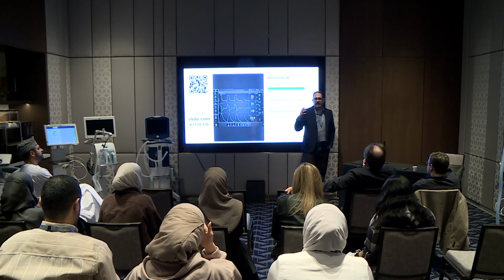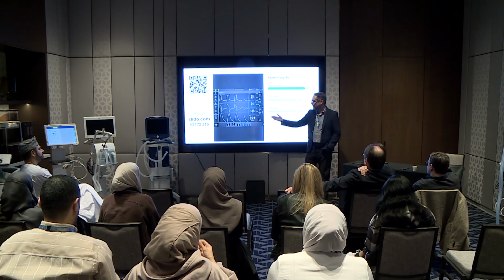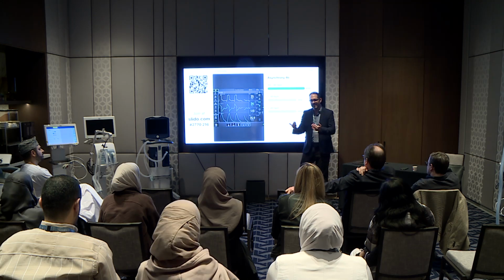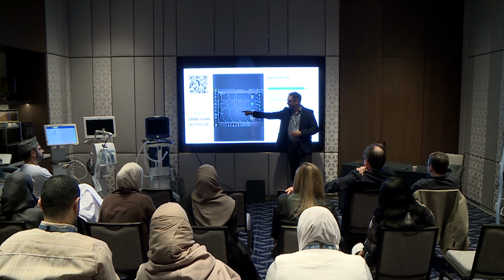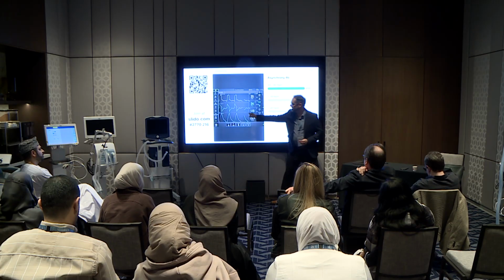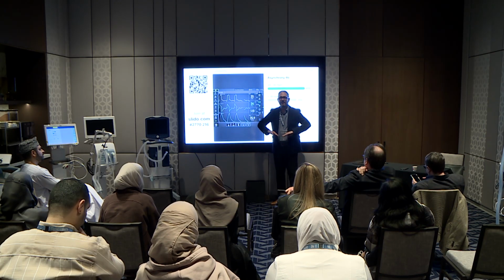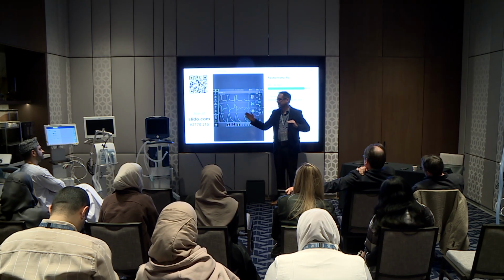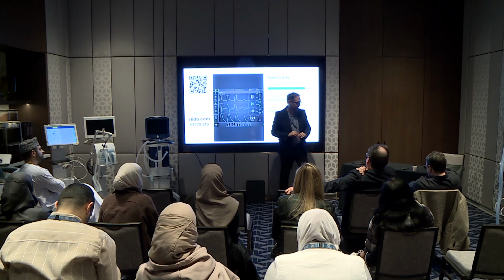So it's important that when you unmask this, you don't immediately go back up. Or if I wean it down and they go over 40, you're going to crank them full of sedation, right? There are things to consider. You have to acknowledge that even if I don't correct this, they're breathing fast. And this is considered eccentric contraction. The diaphragm is lengthening as the lungs empty, and the patient is making a full contraction against that natural response of the diaphragm while they exhale.